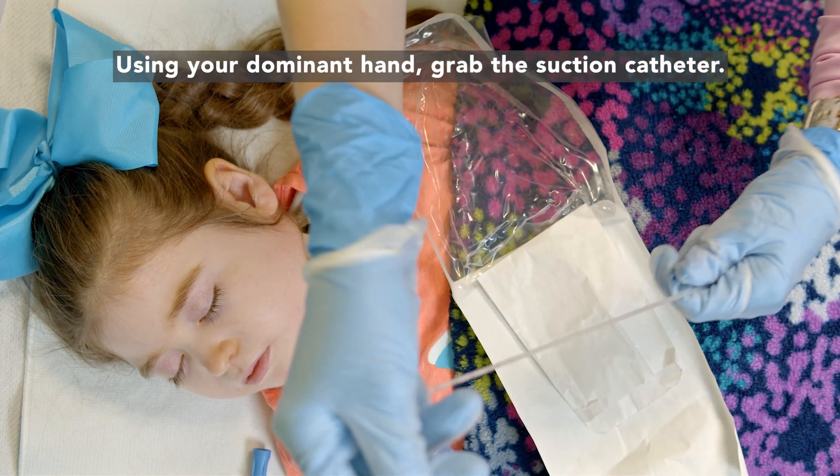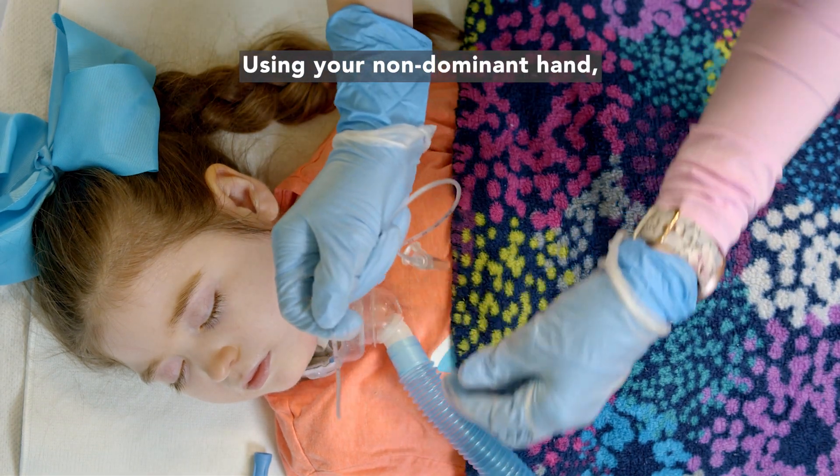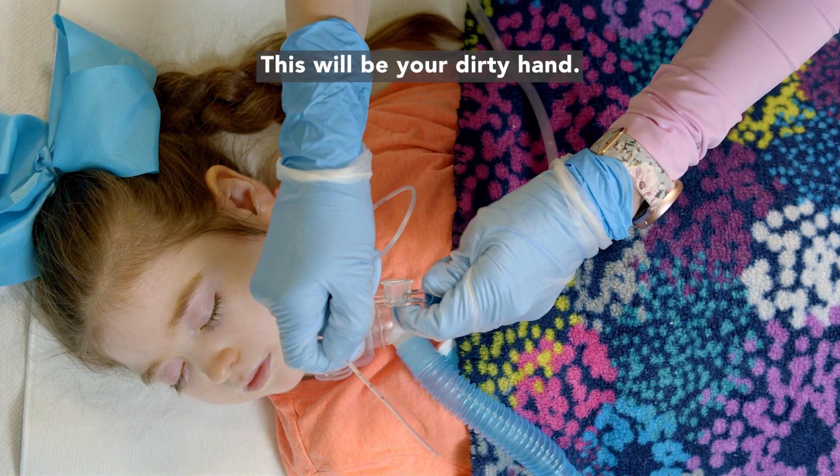Using your dominant hand, grab the suction catheter. This will be your clean hand. Using your non-dominant hand, grab the suction line and turn on the suction. This will be your dirty hand.